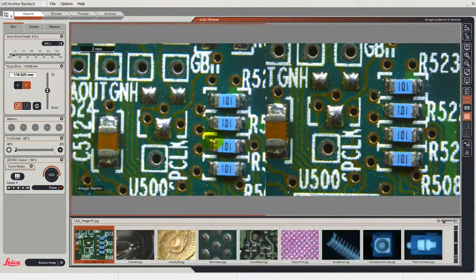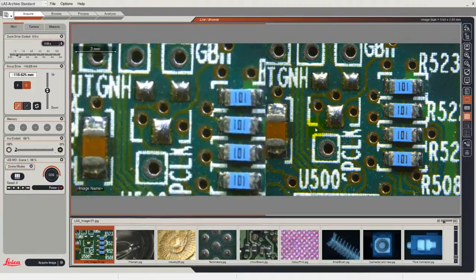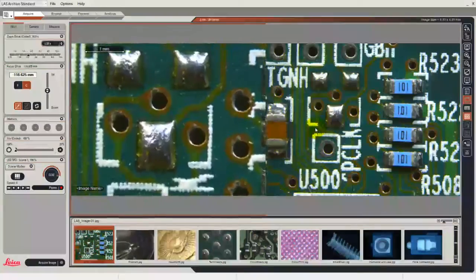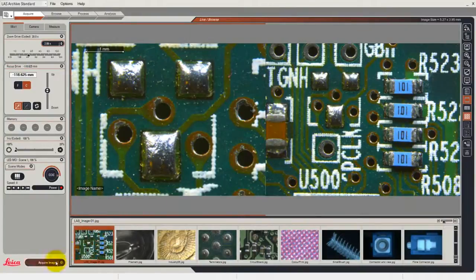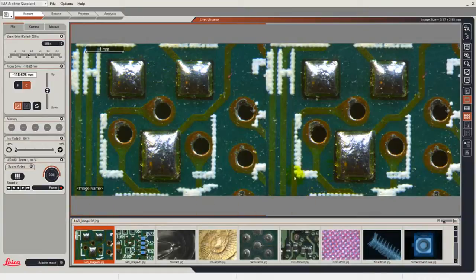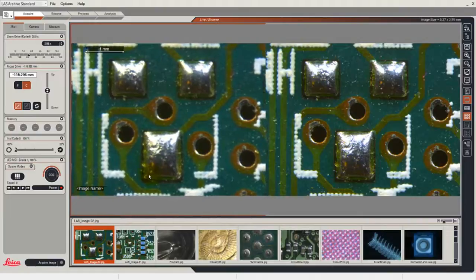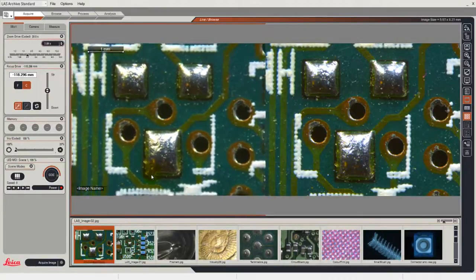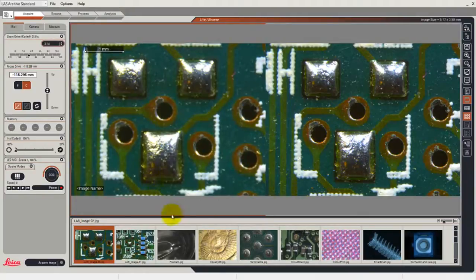I can now look at my image that I have acquired, and on that image maybe I want to take a close up view of this particular solder pad area. So I adjust the zoom on the image to look at that area. Now when I capture this image it will immediately be shown on the right hand side of the screen. I can now compare the image that I have captured with the live image on the left, and perhaps I want to adjust the focus or change the zoom a little bit. I can compare these two images very conveniently.